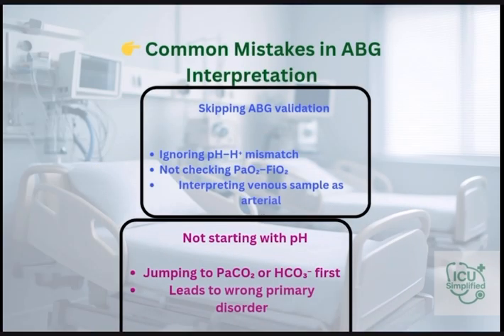Before we wrap up, it's important to highlight some common mistakes in ABG interpretation. One of the most frequent errors is skipping ABG validation. Interpreting an invalid ABG can lead to completely wrong conclusions and inappropriate management.